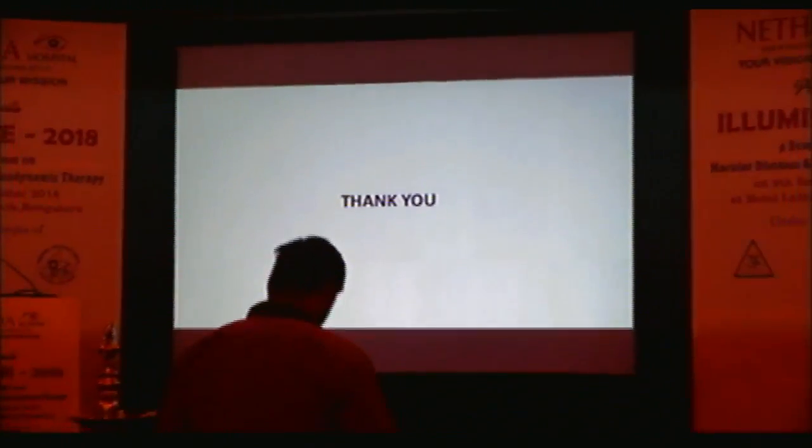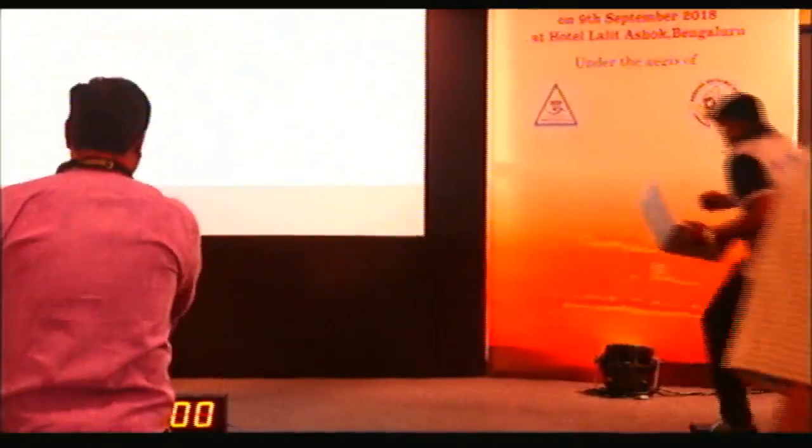Another finding which you definitely notice here is that the area has become much longer, with hyperreflective dots magnified over here. Longer doesn't mean it's doing well, it means it's getting worse. And over a period of time, the hyperreflective dots come down. So that's another marker for us to note in case of chronic CSR.